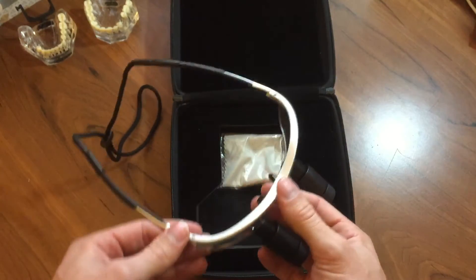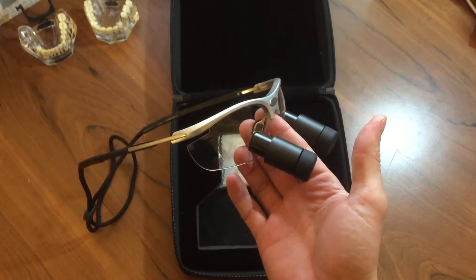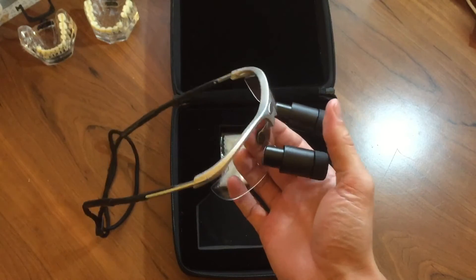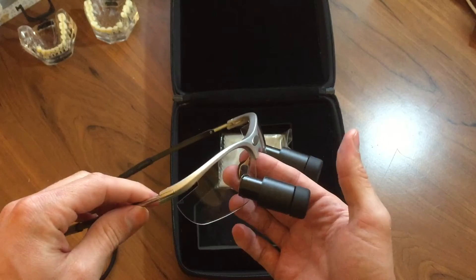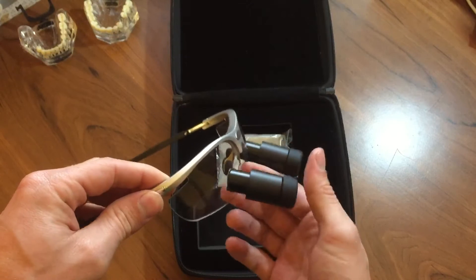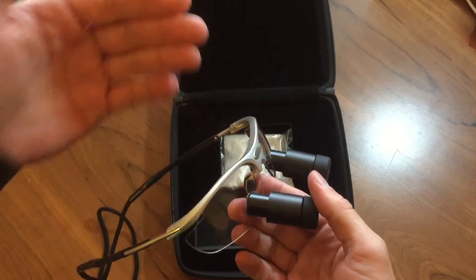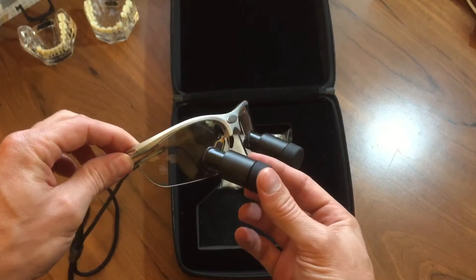These are rated for a working distance of 16 to 20 inches or so, which is right about where I'm at — that's the working distance I usually use. I'm about 18 inches for my working distance. Field of view is 5 inches or 130 millimeters, which I found to be pretty accurate — it might be slightly less than that, but not by much. And then the depth of field is 6 inches or 150 millimeters, which is super nice because you can see from the front of the mouth to the very back of the mouth, assuming you're using these for dental procedures, as I am.